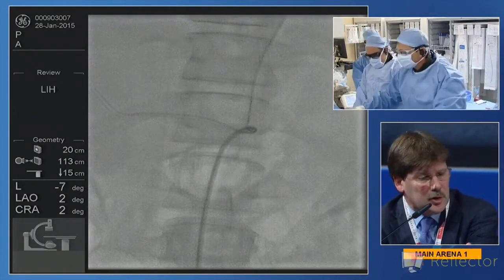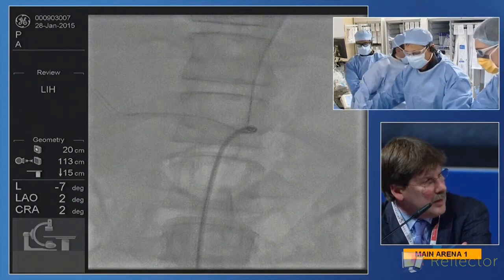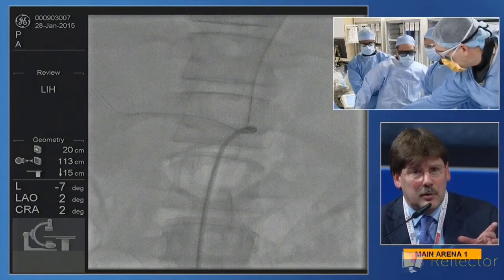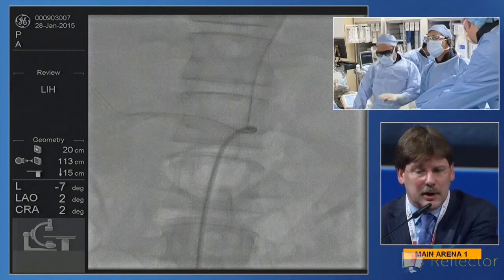What is the usual celiac trunk that you're going to stent? And you know, you're going to use a covered stent. Do you have an adequate landing zone before the bifurcation, the splenic and hepatic? Yes.